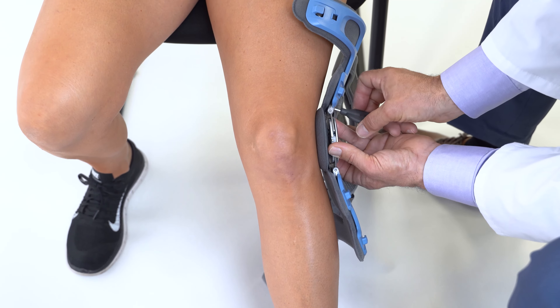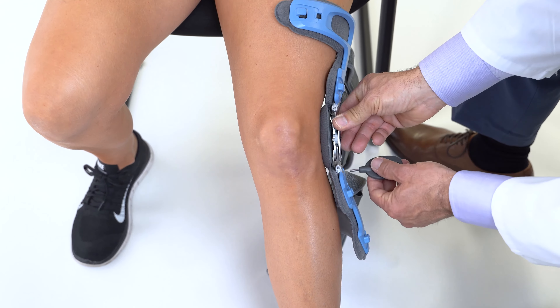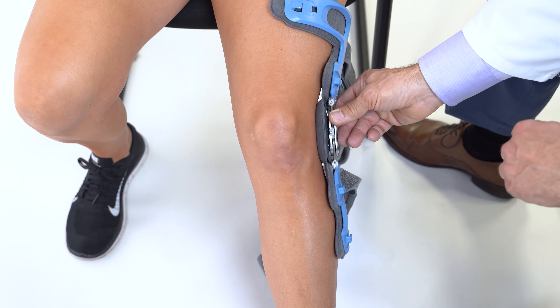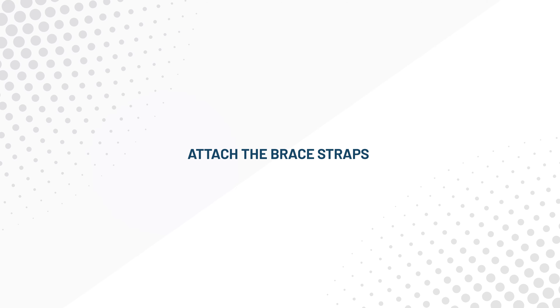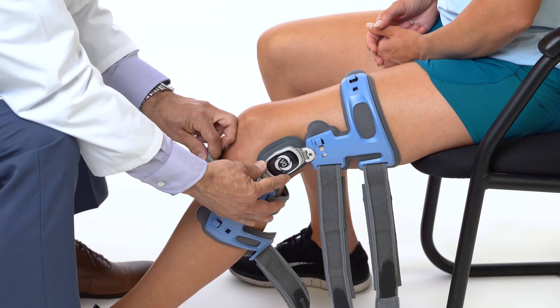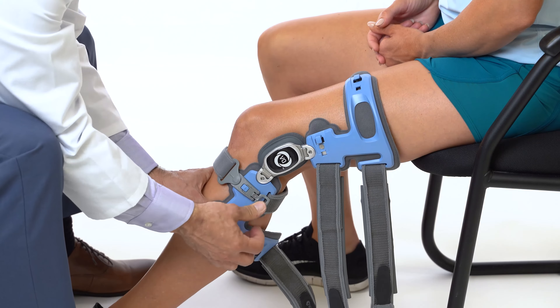When setting up the OActive prefabricated brace, first adjust to the patient's neutral alignment by setting the hinge pad flat against the side of the knee and adjusting the upper and lower sections so the cuffs rest on the leg without gapping or pressure. Attach the strap buckles in the sequence indicated on the frame by hooking the buckle onto the frame and snapping it down securely.